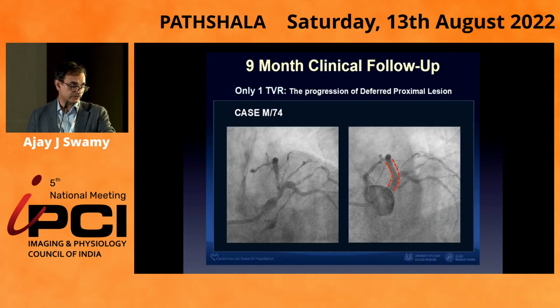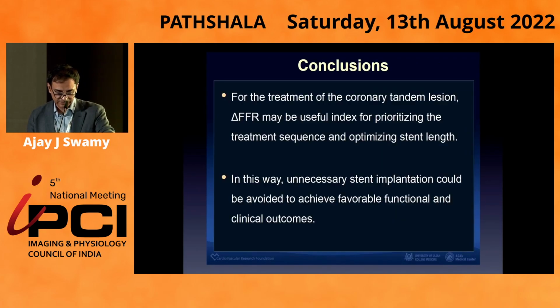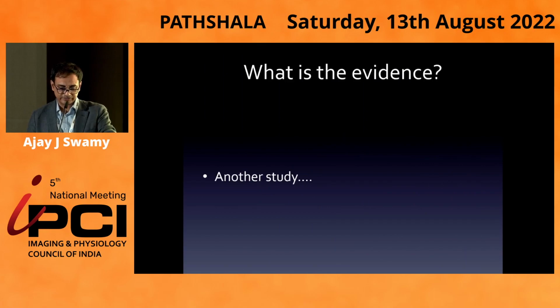9-month follow-up showed only one target vessel revascularization with a progression of deferred lesion. Unnecessary stent implantation was avoided, thus the foundation stones for working forward on this hypothesis occurred.